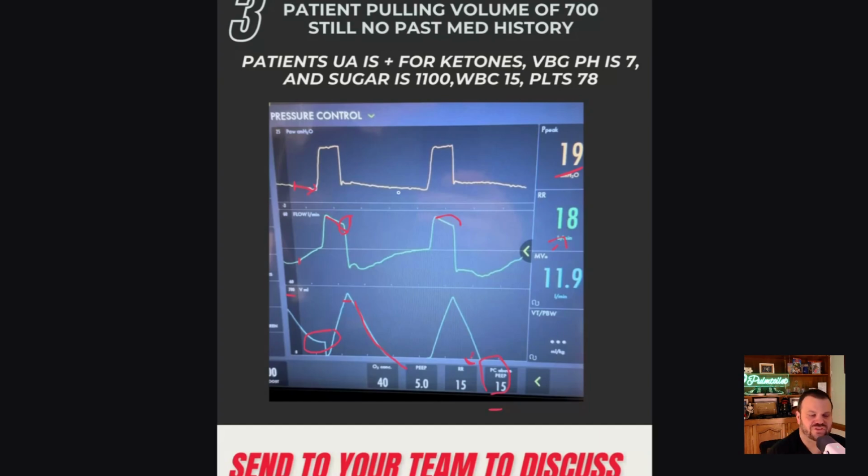Now, as it relates to metabolic acidosis, remember, when we think about the goals of ventilation, we generally have three: keep the pH around 7.2, keep the plateau pressure less than 30, and try to limit the amount of auto PEEP or eliminate it altogether. So sort of very specifically geared to limiting auto PEEP. In this situation, I think we're hitting our plateau pressure goal. There might be some auto PEEP. Certainly the pH goal is not going to be within reach just yet, because if the patient has DKA, they have some other process that's generating acidosis.